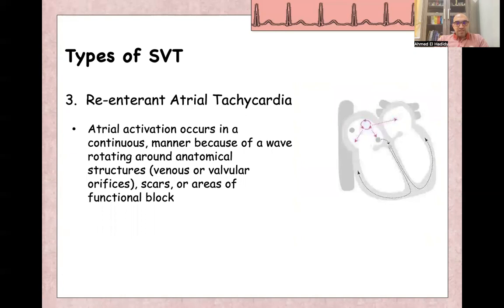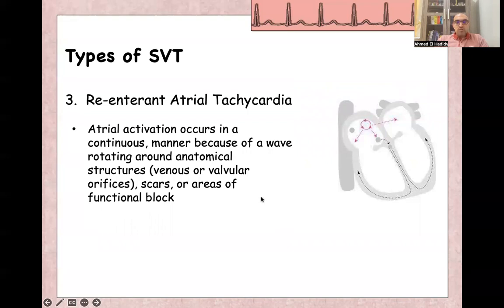Re-entrant atrial tachycardia is a form of atrial tachycardia where there is atrial activation by continuous depolarization from a rotating wave around an anatomical structure like the IVC, valve orifice, scar, or even an area of functional block. This re-entrant tachycardia is not the same as atrial flutter, which involves the IVC and the tricuspid isthmus — it is a different location of re-entrant tachycardia.